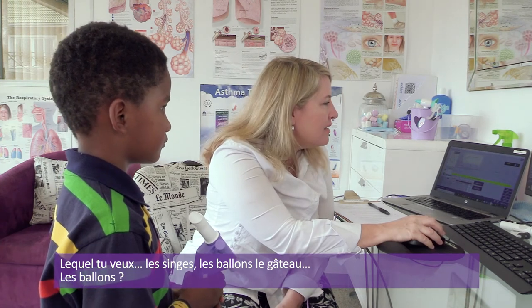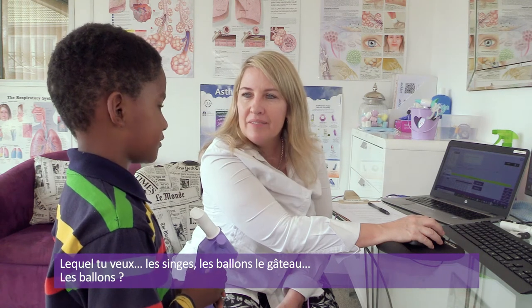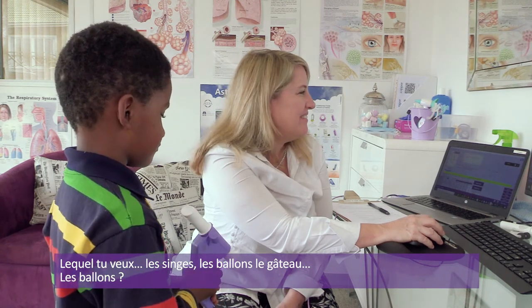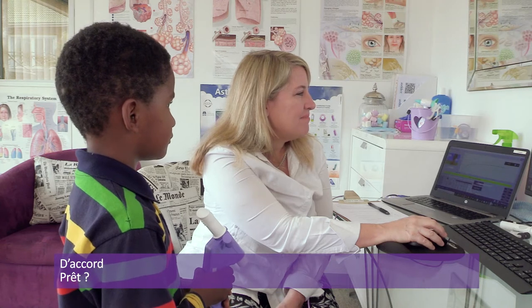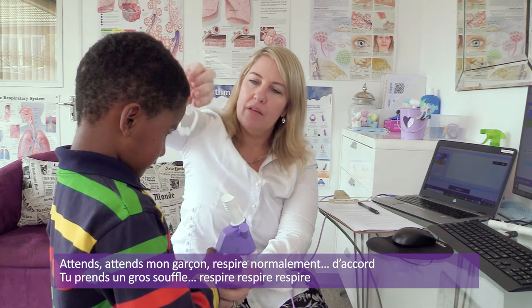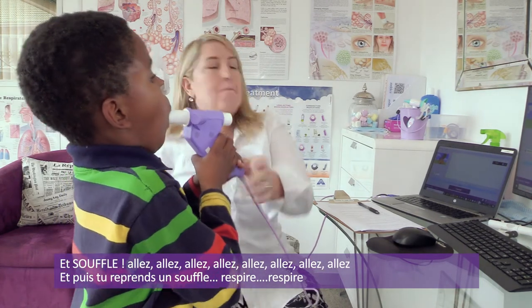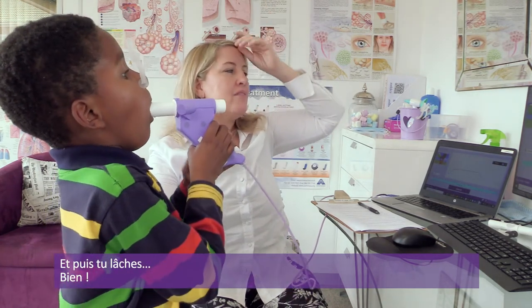Do you want the monkeys or the balloons or the cake? Which one would you like? Balloon. Balloon, okay. All right. Okay, are you feeling ready? All right. Wait, my boy, wait, relax. Rest. Breathe. Okay. All right, are you ready? Okay. Take a nice deep breath in. Fast as you can. Go. And breathe in. And relax.